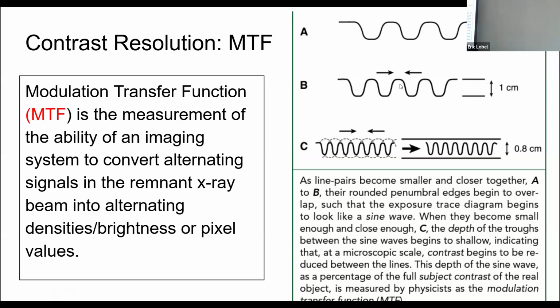The frequency increases. We haven't quite talked about it, but there's a reconstruction, and it's similar in MRI, but now it's being applied to radiography, where we take wave and frequency information and turn those into grayscales to get our contrast.